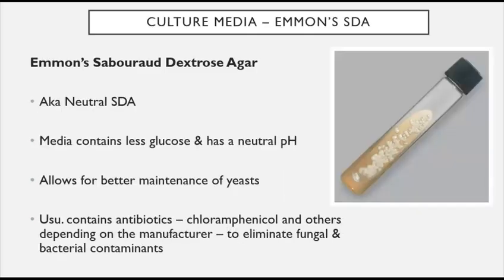The Emmons SDA agar plate or tubed media is a neutral media. It contains less glucose and has a neutral pH. It allows better maintenance of yeast. It usually contains antibiotics, and this is a good media to eliminate fungal and bacterial contaminants.